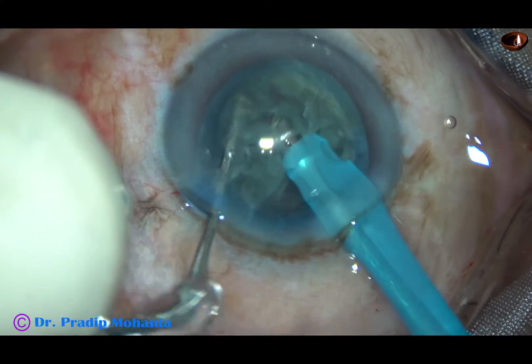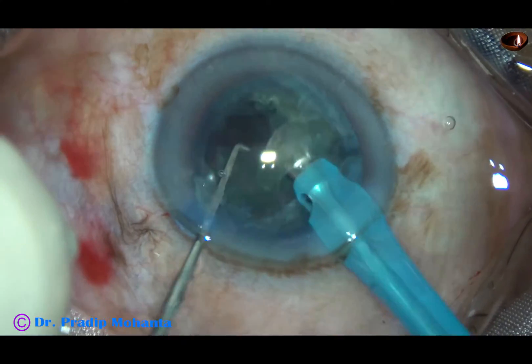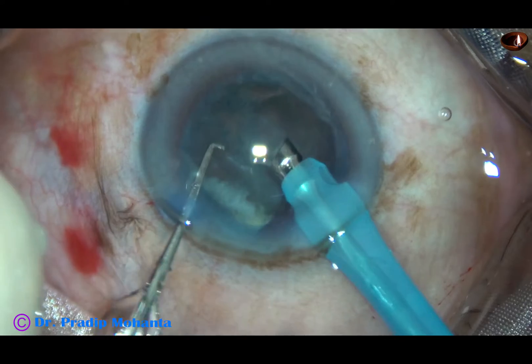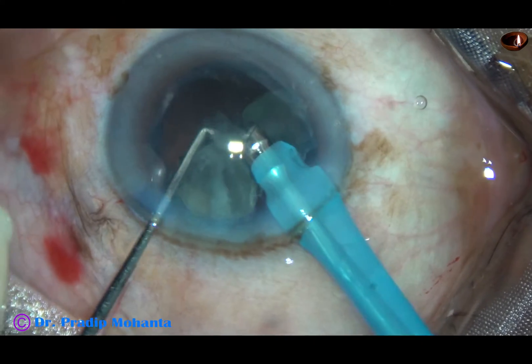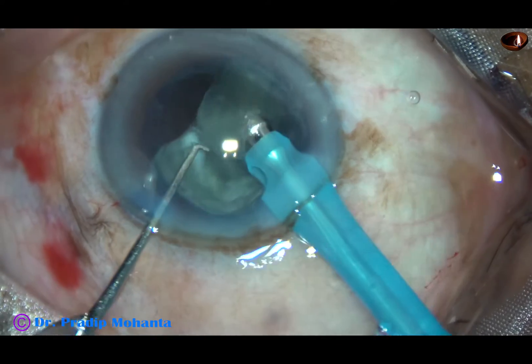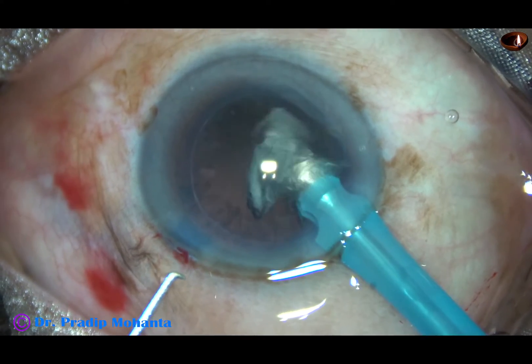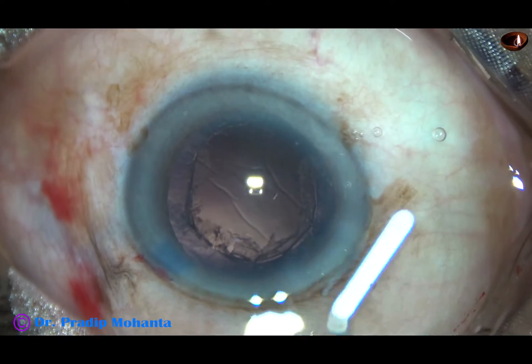Now I go to FACO2 mode — hold the nucleus and chop. FACO2 mode means high vacuum mode: vacuum is 400 mmHg, flow rate is 40 ml per minute. I am going to hold the nucleus and chop them into smaller pieces, then emulsify the pieces. This is the other hemi-nucleus. The periphery is so soft that I am not able to chop it; however, the hemi-nucleus tumbles and I just cut it with ultrasonic energy and emulsify the smaller pieces. At this time, to emulsify the nucleus, probably only 30% ultrasonic energy is being used. The nucleus and epinucleus have been nicely managed.